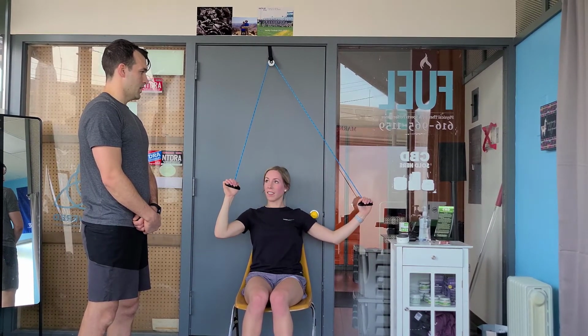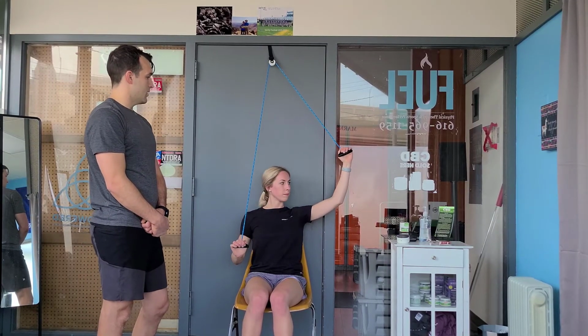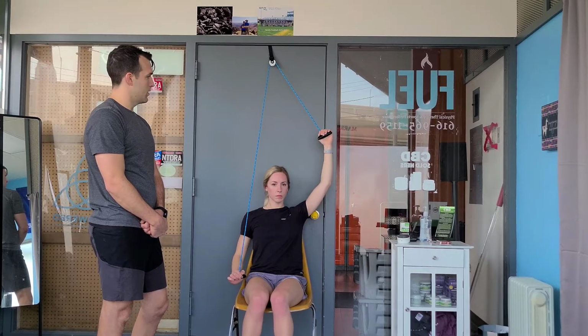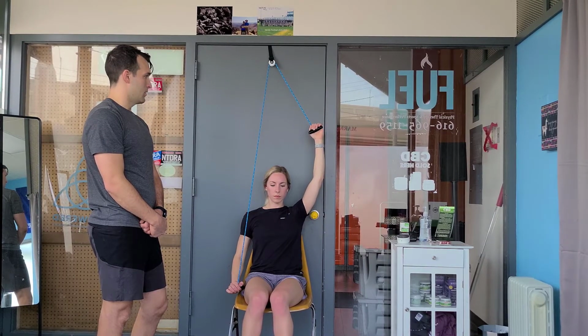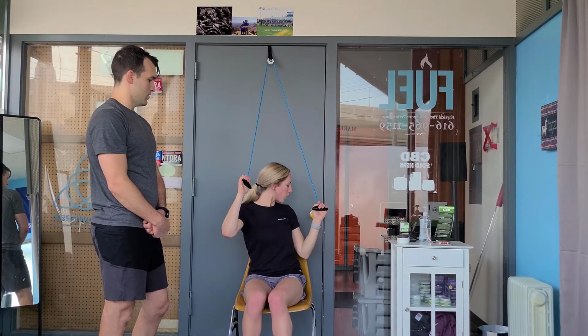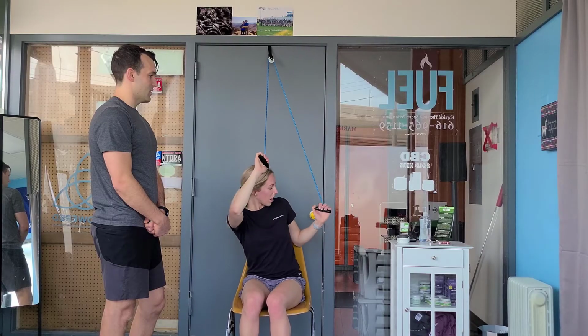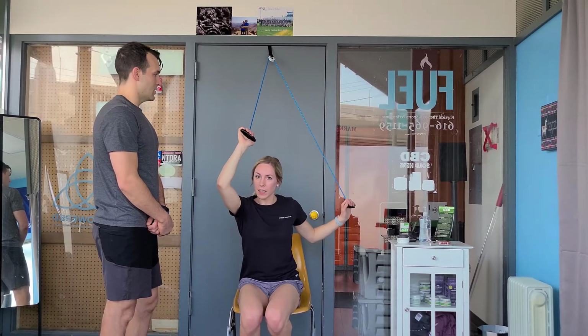Kind of do that again. And again, that left arm isn't doing anything, it's just going along for the ride. The right arm is doing all the work. And then we'll do internal rotation, which I want to make sure I'm not super close to the door, so I guess I could probably switch forward to my seat. That might be a better idea.